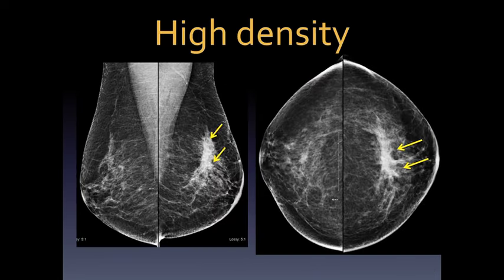Here is a screen-detected abnormality. If you look carefully, you can see a focal asymmetry — asymmetric tissue in the right upper outer quadrant, quite asymmetric compared to the left side where no similar abnormality is seen. By definition it's a focal asymmetry because we see it in two views. This ended up going for further investigation and was an invasive ductal carcinoma — ultrasound showed an abnormality and led to biopsy. Focal asymmetry is important to investigate further.